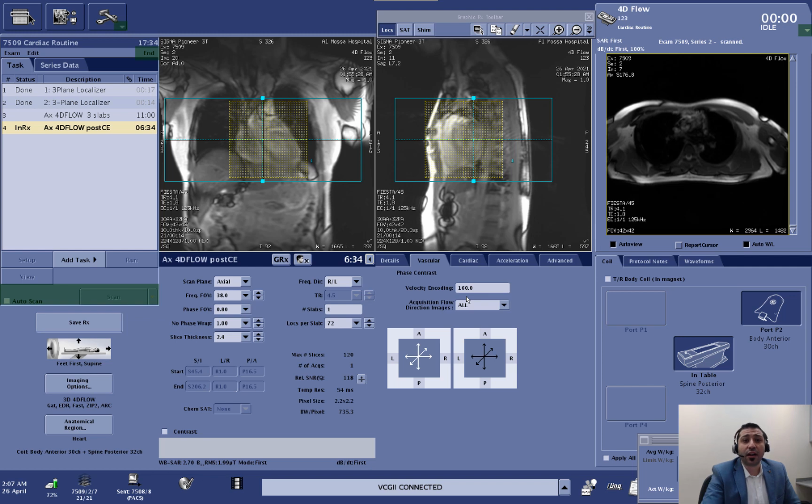And if aliasing artifacts are present, accurate flow visualization and quantification may be compromised unless anti-aliasing correction can be successfully performed. As a general rule, to capture the best image quality, the chosen velocity encoding should represent the physiological velocity of the vessel of interest and be adapted to the measurement of interest and present hemodynamic conditions.